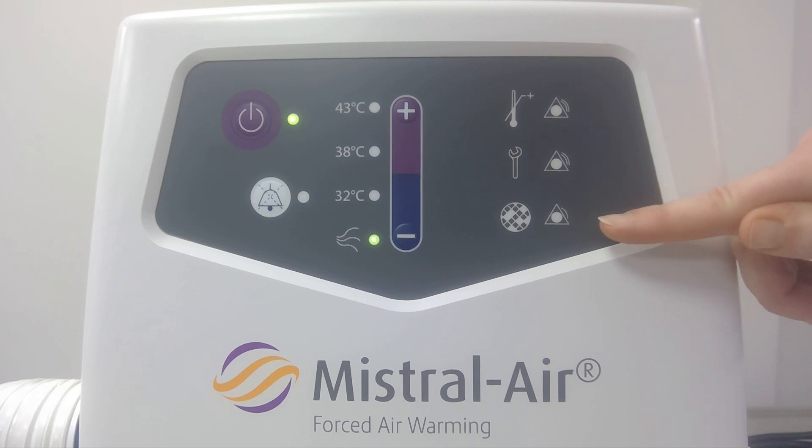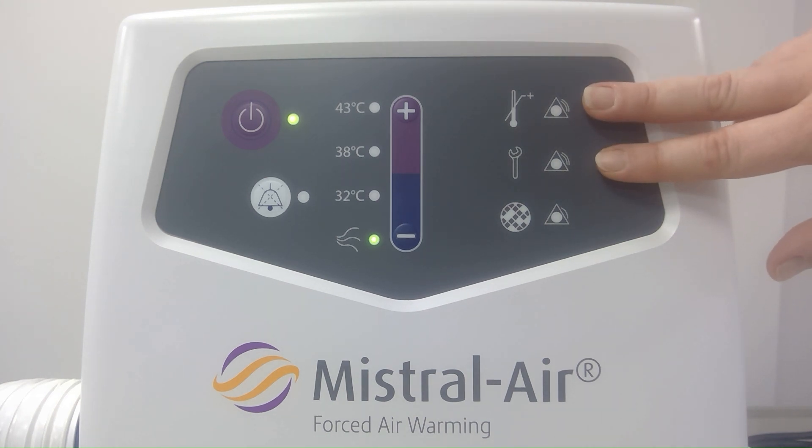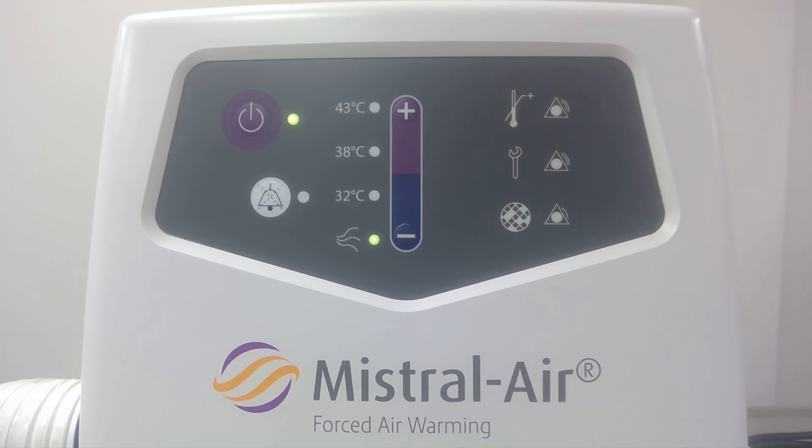The third alarm symbol at the bottom is for your air filter replacement alarm. This will indicate once your air filter has had over 2,000 hours of use and will stay lit until the air filter has been replaced. To reset the top two alarms once the trigger and issue has been rectified, we need to reset our unit which we can do by turning on and off at our power supply. To turn off the unit we can press the power button.